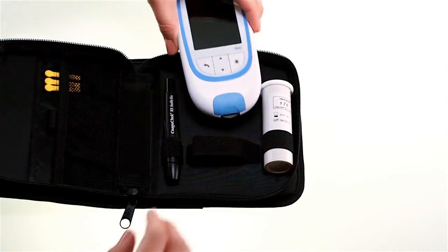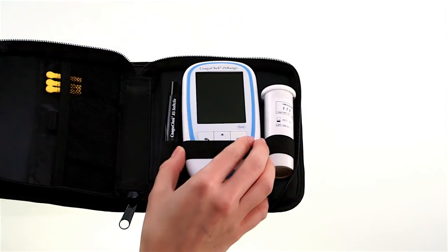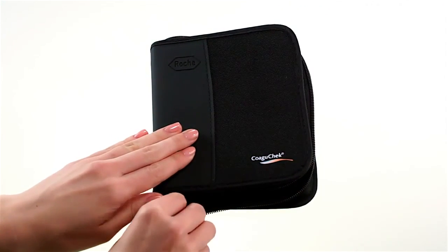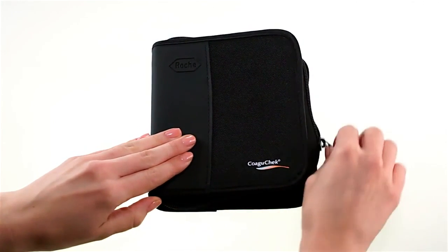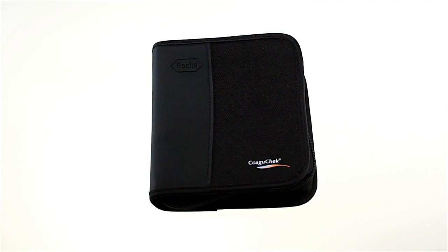Remember to store everything in the carrying case for the next time you need to test. You will find more information in the user's manual. If you still have any questions, just call your COAGUCHECK customer care line or visit our COAGUCHECK website.